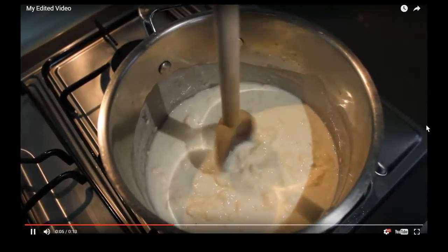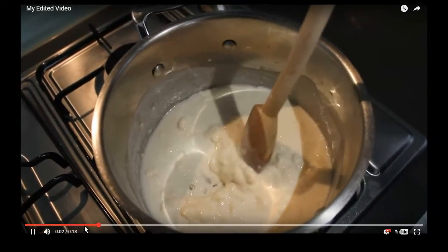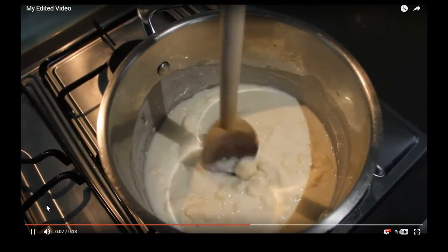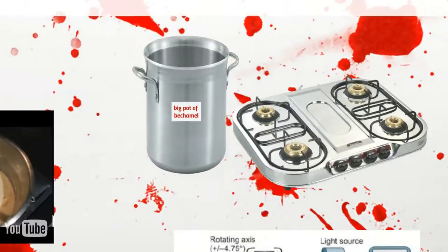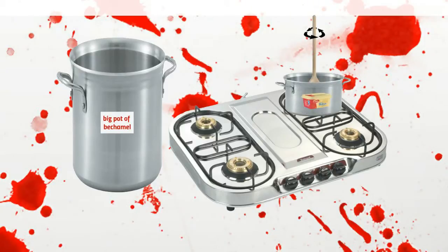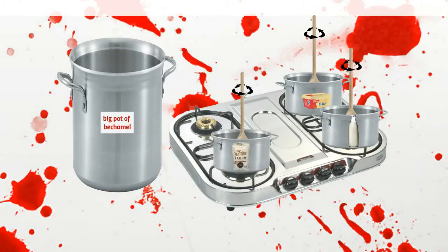But just imagine instead of doing that, you were to twirl your stick around your wooden spoon and measure the torsion. In that example, it's very similar to ROTEM. And to take that a little bit further, just say you had a massive dinner party and you had this huge pot of bechamel sauce and you wanted it to be perfect for your guests. So to test it without spoiling the big pot, you take a sample and you put it in a pot. Put some butter in there. Take another sample. Put some milk in this one. Another sample. Put some flour, maybe a fourth one. That's 4 burners or 4 channels.